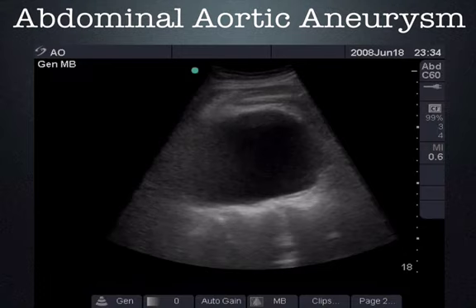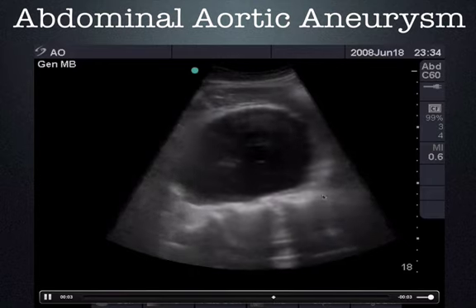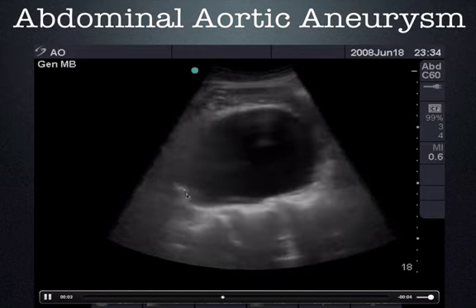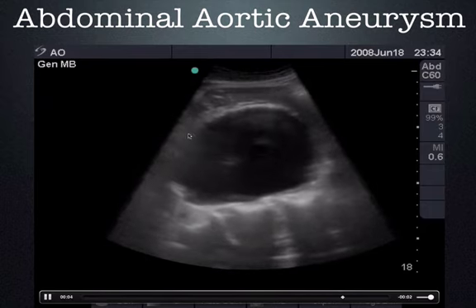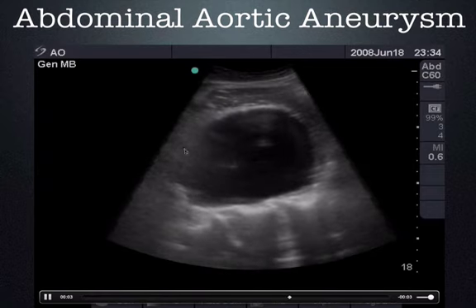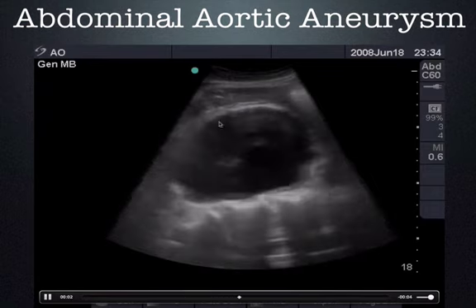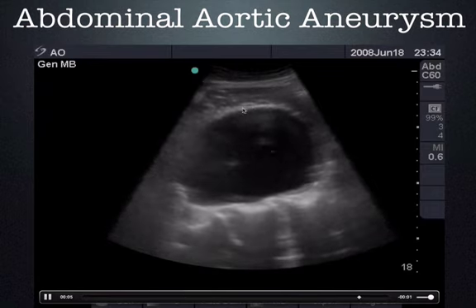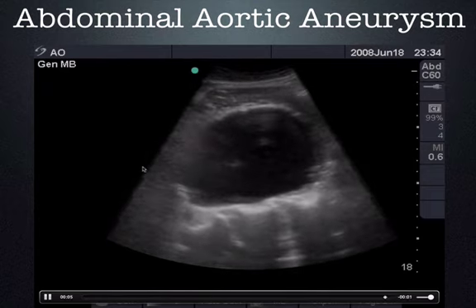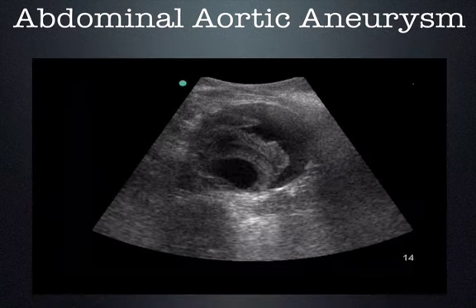Now this is the same abdominal aortic aneurysm, and they've turned long axis here, and you can see the spine here, and here is the aortic aneurysm, a nice fusiform aneurysm, and you can see that it tapers on either side, and the normal segments of the aorta are hidden in the bowel gas. So again, this illustrates quite nicely that the most anterior portion of the aortic aneurysm is only 2 to 3 centimeters of depth and is quite visible despite the fact there is a lot of bowel gas around this aortic aneurysm.